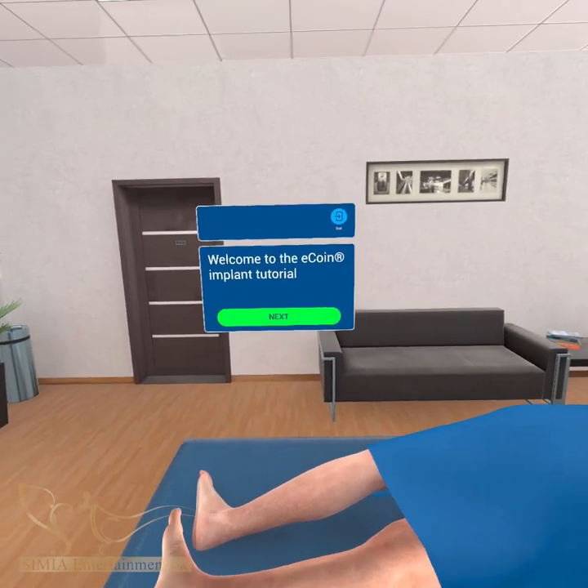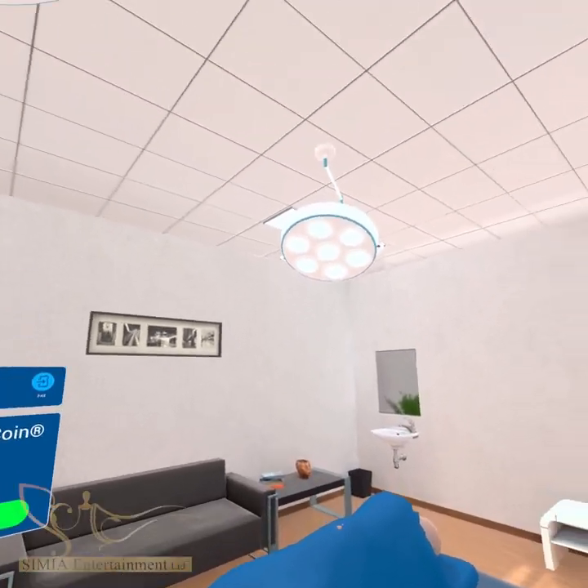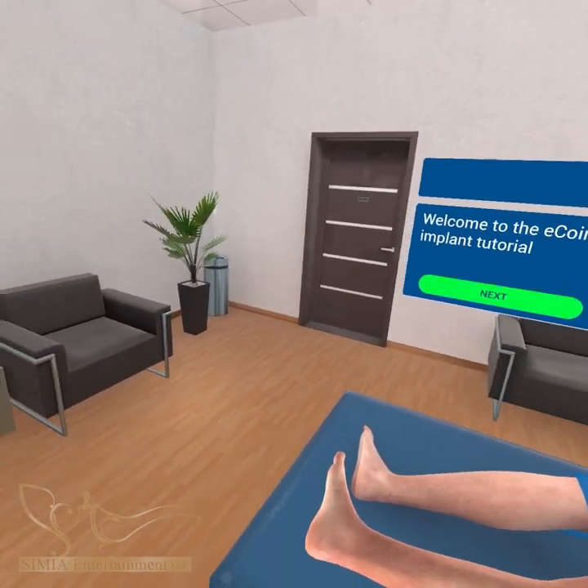Welcome to the ECOIN tibial implant tutorial. You will learn to implant the ECOIN tibial stimulator by following these outlined steps.